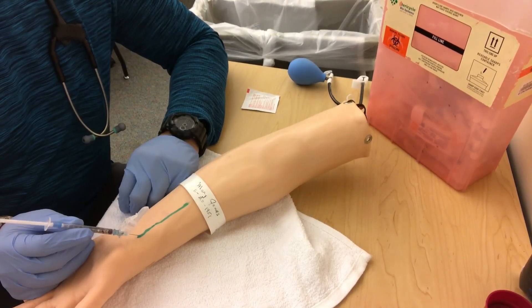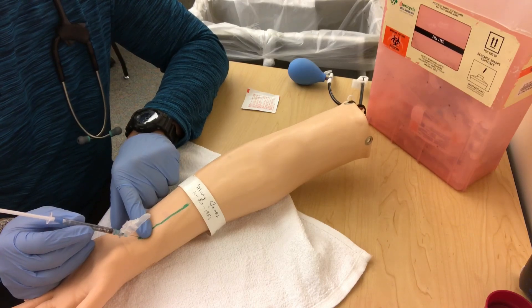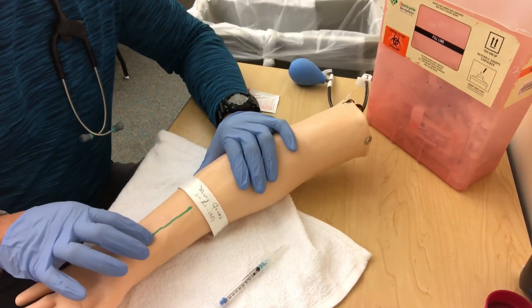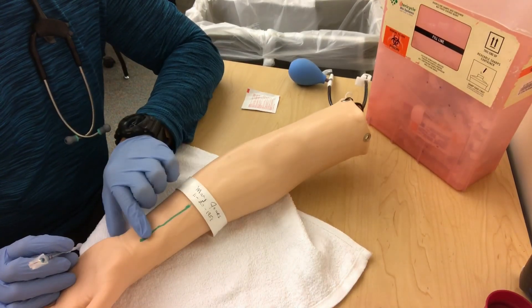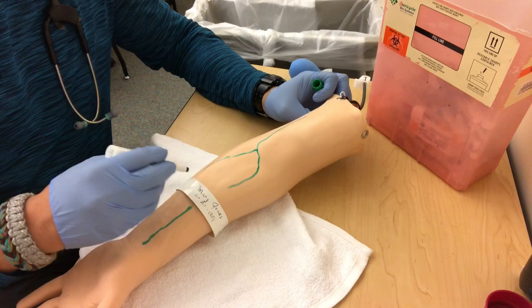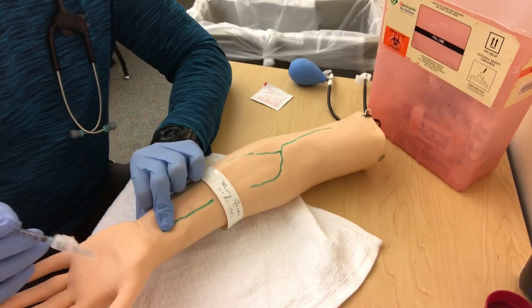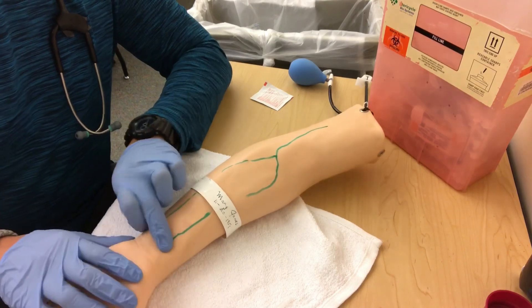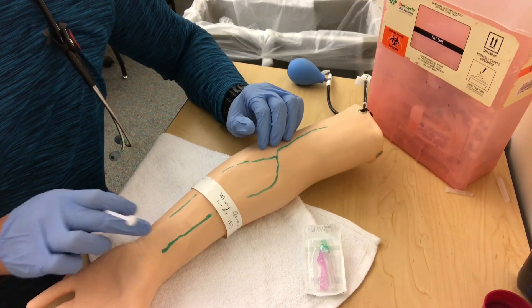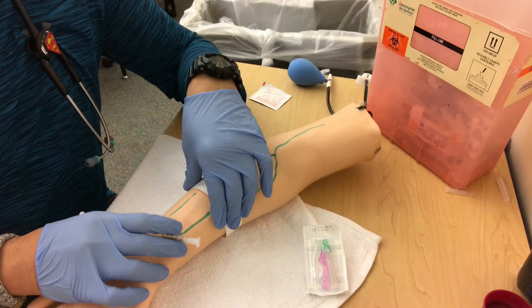This takes practice — it takes a million of these. All patients are different, but we all have the same arteries in usually the same place. You'll get so good at this that you'll do anatomical pokes where you won't even feel for it first. Sometimes you'll have a sick patient where the pulse isn't palpable and you'll have to do an anatomical poke — that's something you learn as you get better. If you've tried everything — poked twice, can't find a radial or brachial on either side — another option if your facility allows it is a femoral artery poke.